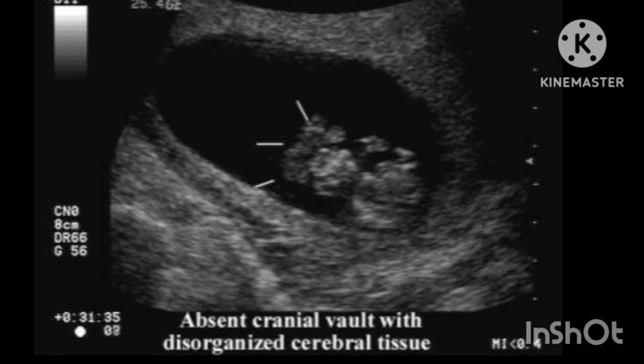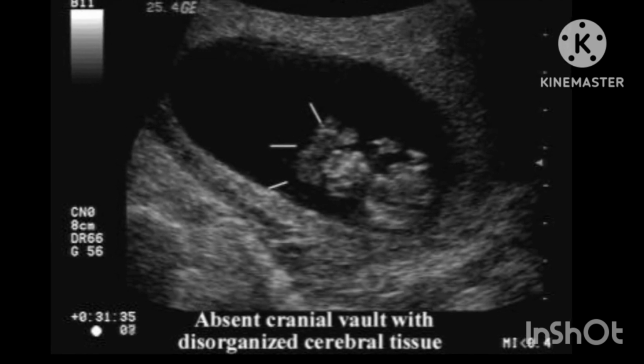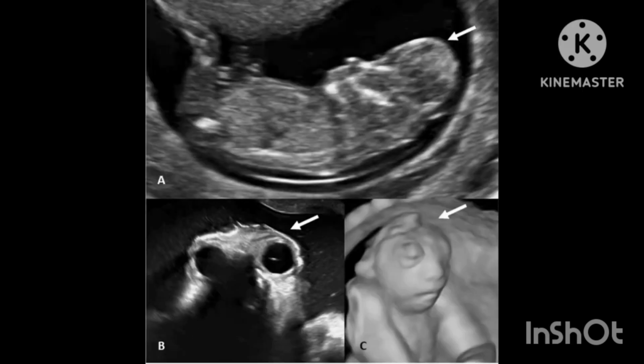On ultrasound examination of the fetus, the calvaria and brain parenchyma are not visualized. Biparietal diameter and head circumference cannot be measured. A coronal section through the fetal face shows frog-like bulging of eyes and absent frontal bones. An anencephalic fetus has a triangular-shaped face and lacks the anterior region of the skull, both of which can be seen on the sonogram.